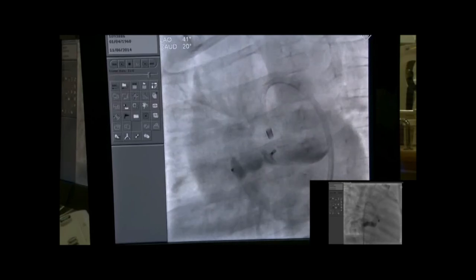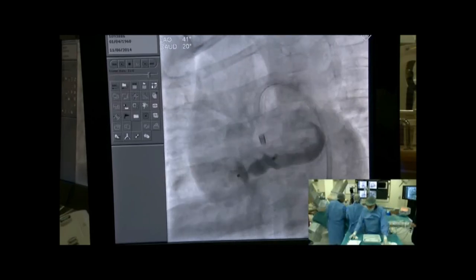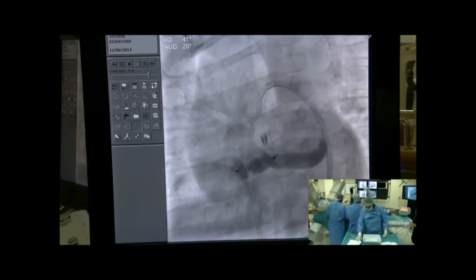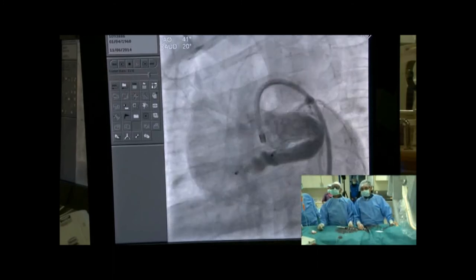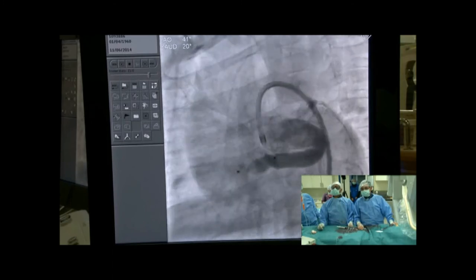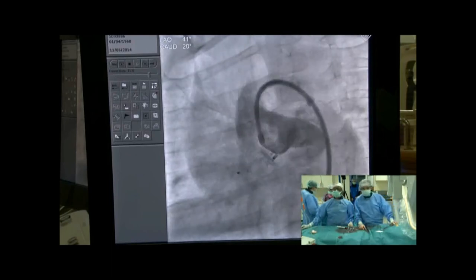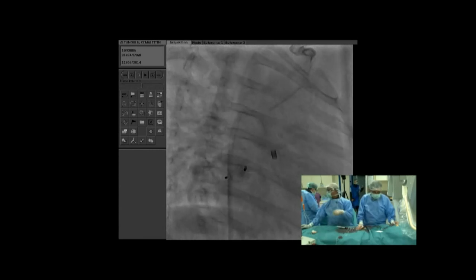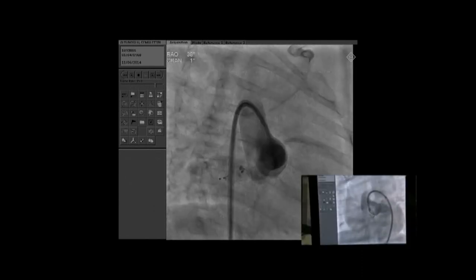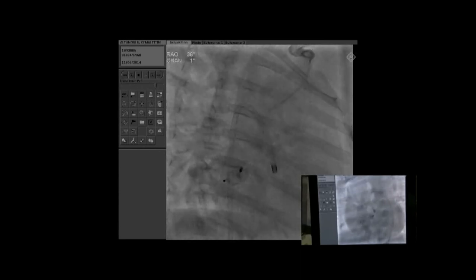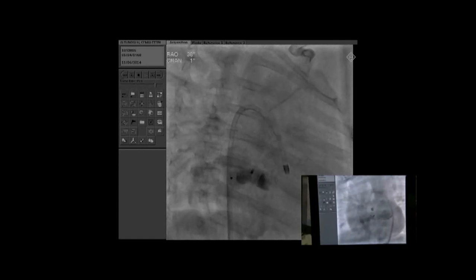Are we 100% sure that the coronary sinus is not being occluded? The exit point is clearly at the SVC junction, and it may be close to the coronary sinus — do we know whether the coronary sinus is patent? We don't. Looking at the RAO projection it looks well away. Replaying the last image: the right coronary looks all right. You can see the coronary sinus in the late phase — it's way down, well clear. Yeah, I agree. Thank you very much, Joe.